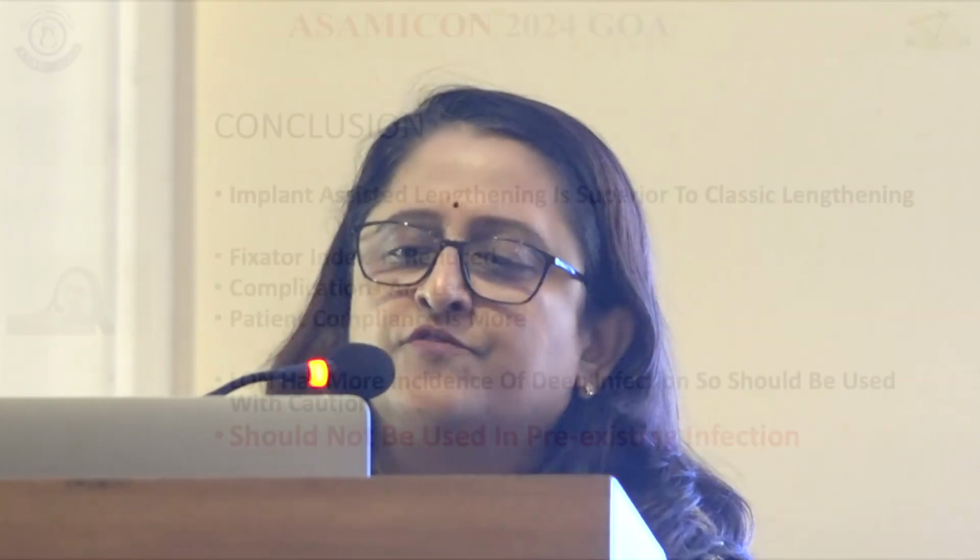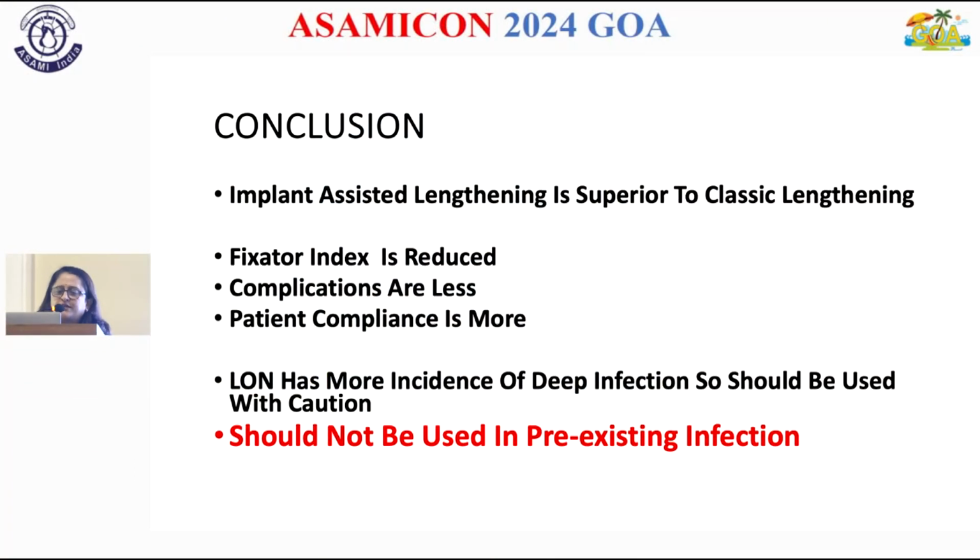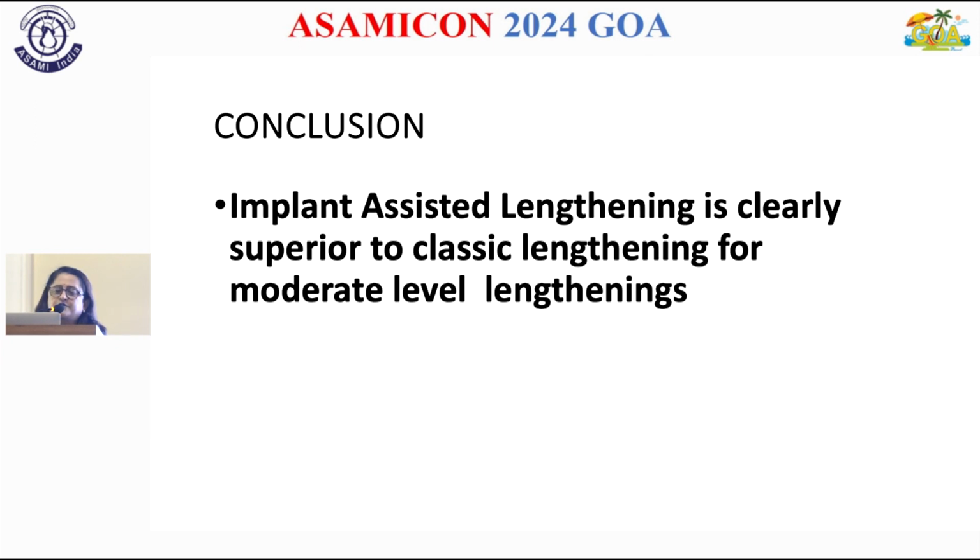So to conclude, I feel implant-assisted lengthening is superior to classic lengthening. Fixator index is reduced, complications are less, patient compliance is more, and the only problem with LON is deep infection, and especially it should not be used with pre-existing infection.